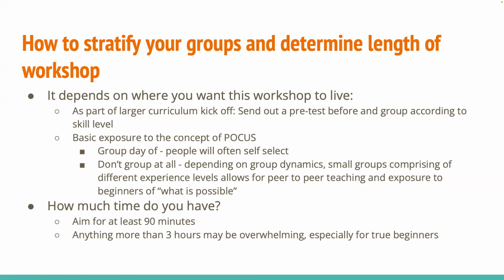When I did it, I really just wanted to expose my hospitalist colleagues to what ultrasound is. I was going to kick off the curriculum later in the year, but I really just wanted to get buy-in from them to get machines and to allow time to teach during division meetings. So the first year was a little bit more of marketing, like, this is all that can be done. Here's some cool stuff. And then the next year after that was a little more dedicated to one or two applications because I knew I had the buy-in from those participants.